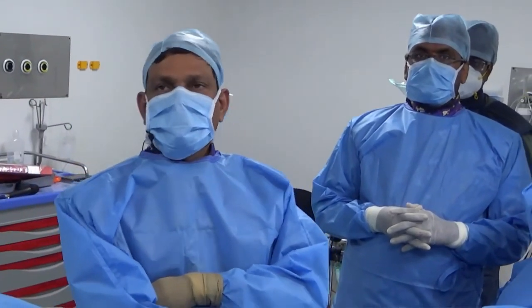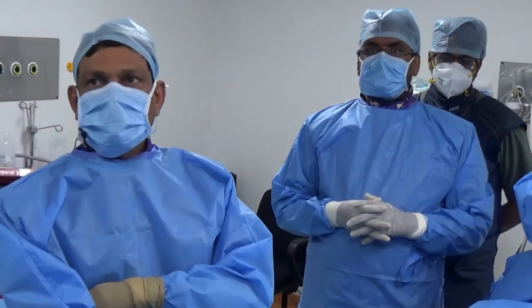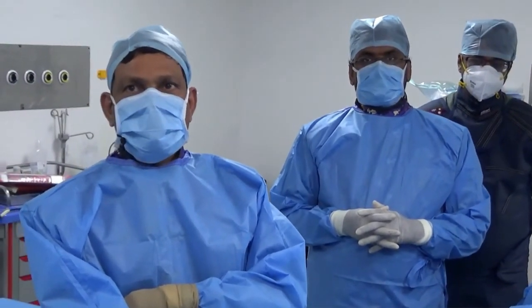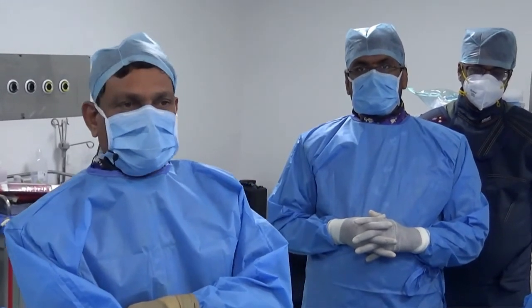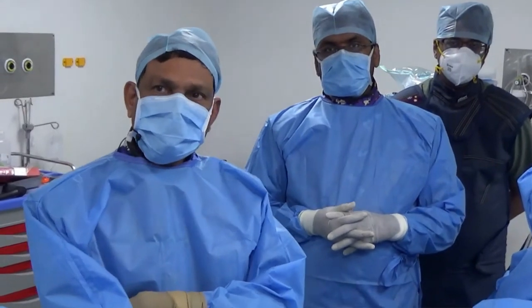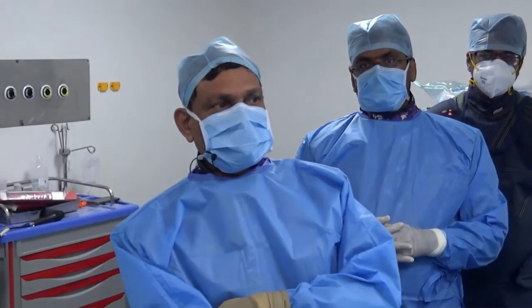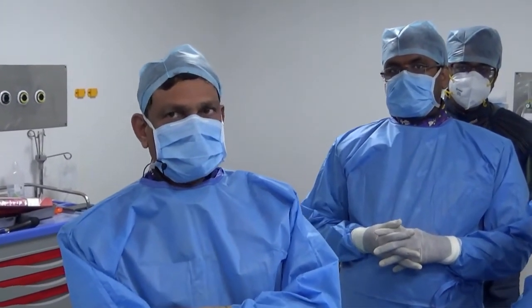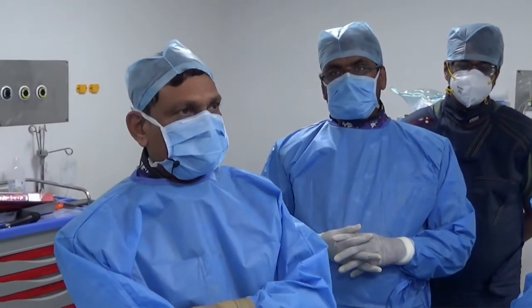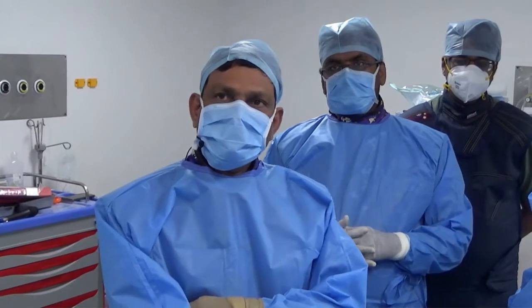Okay. All right. So I still think it's a very well done job, Nageshwar. It shows the versatility of your device, a truly multifunctional device which you can put in a variety of situations. Good technique that you demonstrated that everybody can learn from. The point of making a wire, snaring the wire, yet delivering from the artery, using a buddy wire, getting as distal as possible. All those things beautifully demonstrated, and a great case.